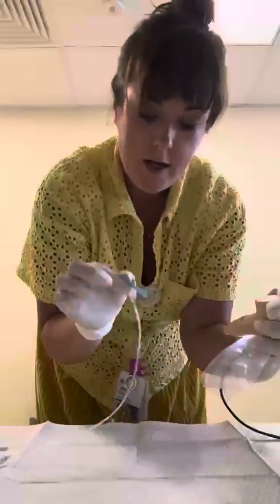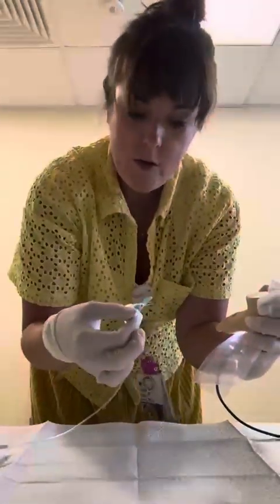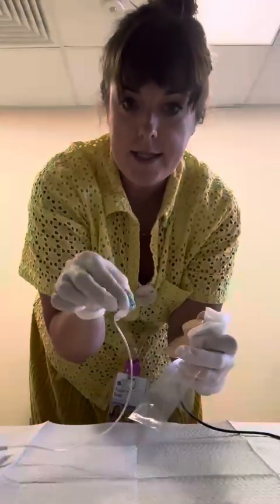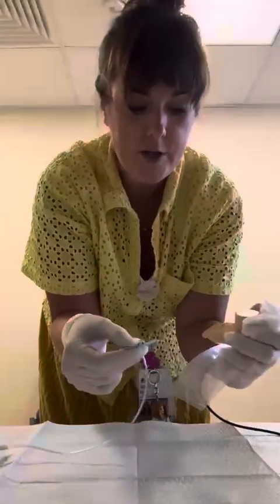The trick with butterflies, bevel up always, and I like to hold this. Some people like to hold it together like this. It's however you want, but just don't push that little black arrow, which will retract your needle.